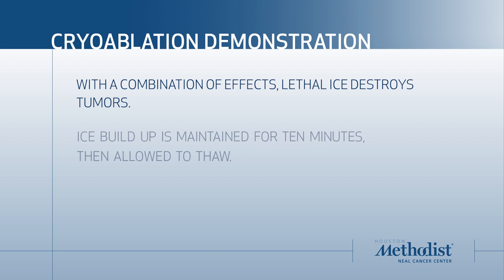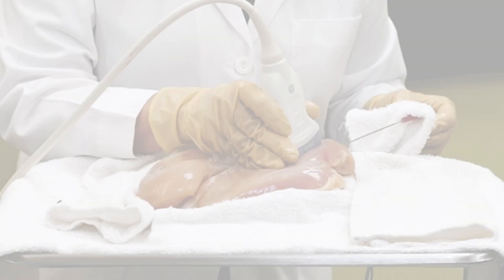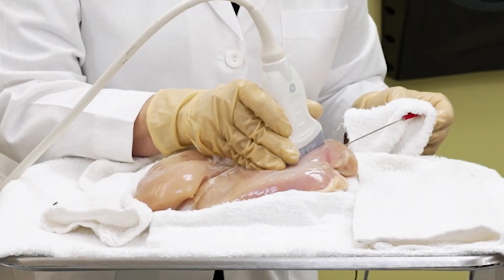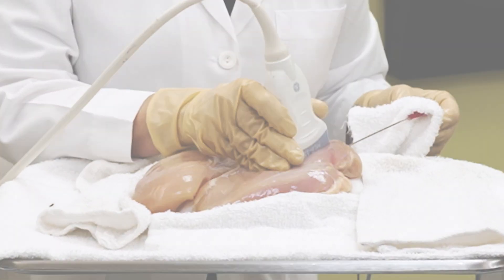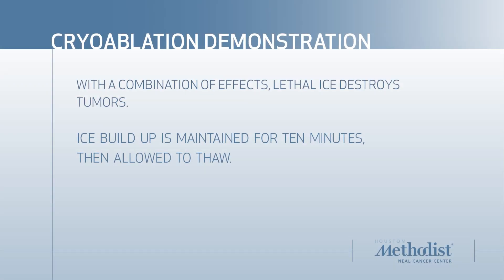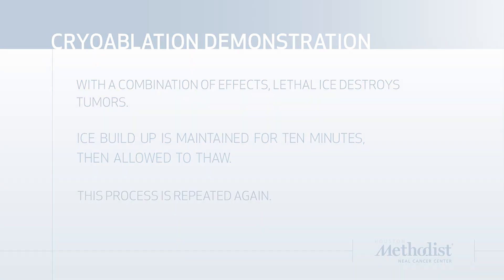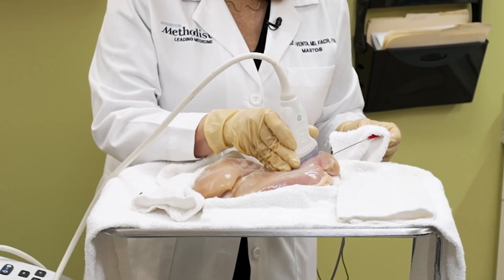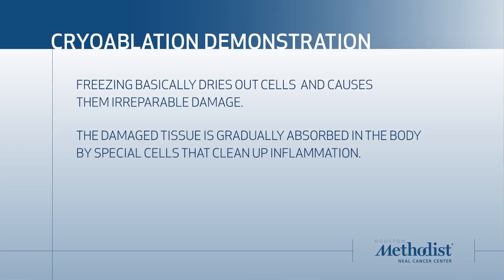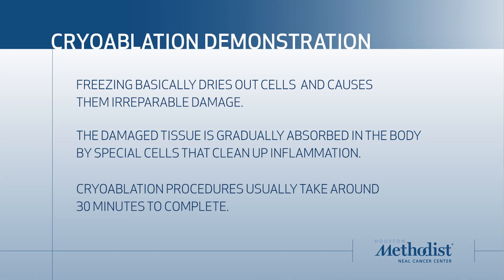Typically, the physician would maintain the ice buildup for approximately 10 minutes before allowing it to thaw. Once the initial ice ball has thawed, the process is repeated, freezing it again for another 10 minutes, followed by thawing. This completes the cryoablation procedure. The process of freezing and thawing of the phantom during a cryoablation procedure usually takes around 30 minutes.